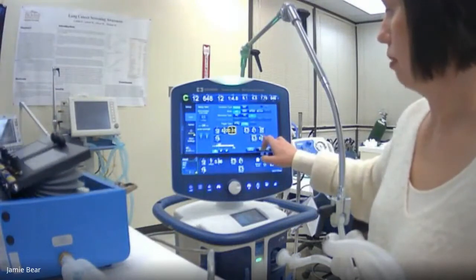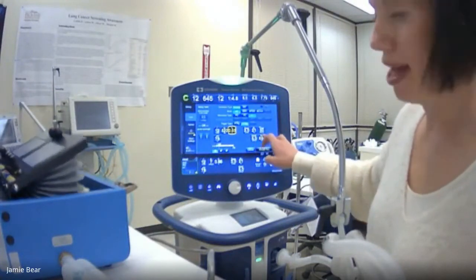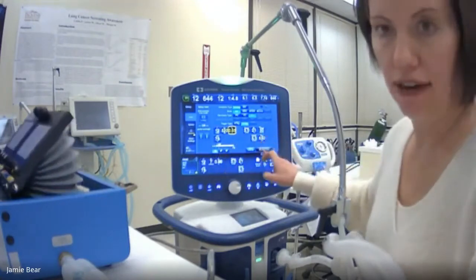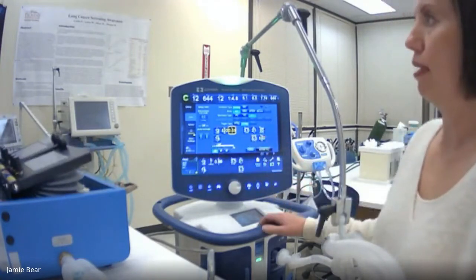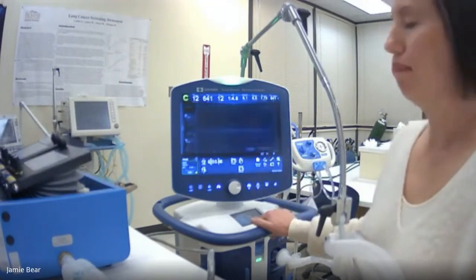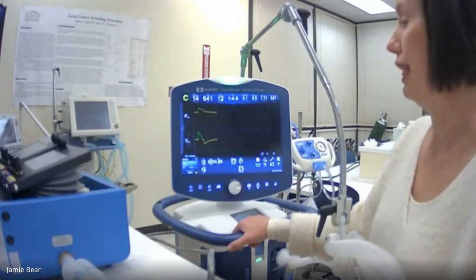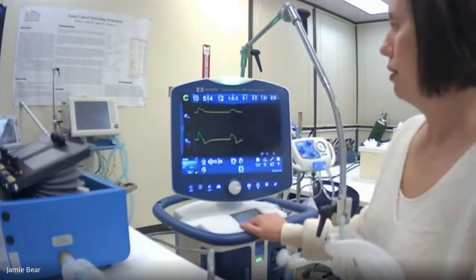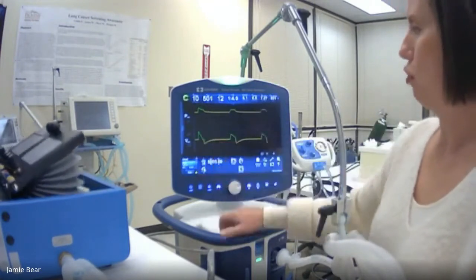We are now going to be really careful and set a high peak as well as a high tidal volume. So here we have set the high tidal volume to be at 650, and since this patient's approximated to be 65 kilos, it's about 10 mils per kilo. So once again, we always have to be safe and make sure that we get safe parameters in here. So here we go again, and now you'll see as it transitioned over.